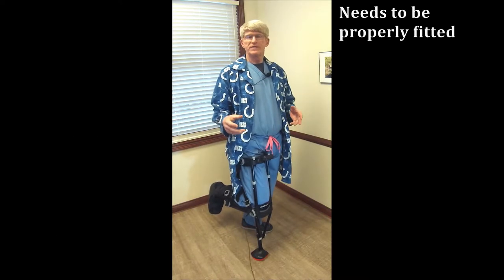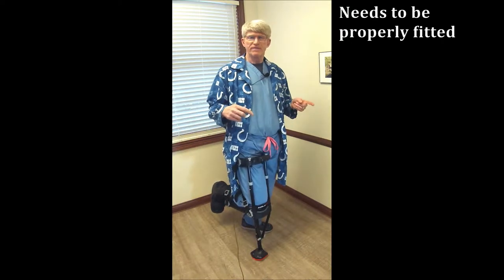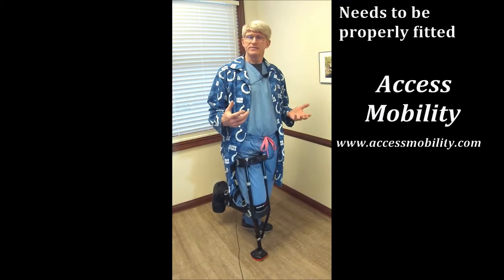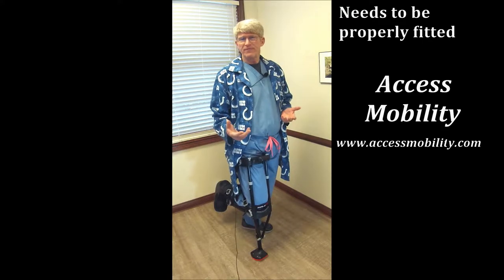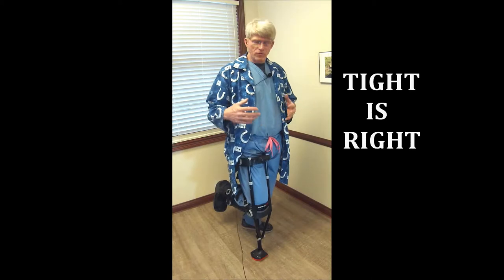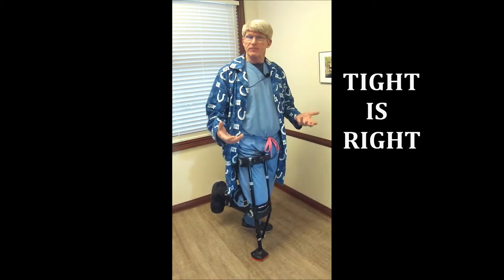Now, the critical thing with this is fitting, and I highly, highly recommend that you go to a specific fitting center for this. The local one is in Beach Grove — it's called Access Mobility, and they're very, very good with that. I stay away from the go-sales, internet, eBay. You may save five or ten dollars, but you won't get fitted properly, and that's what makes this thing really, really work. Remember, tight is right — the tighter the straps, the more secure you are and the better it will work.